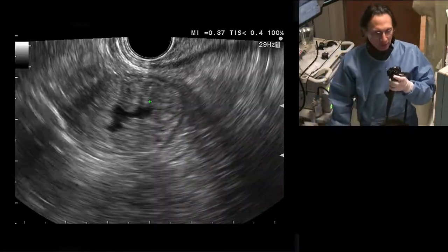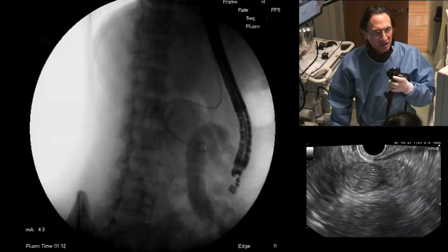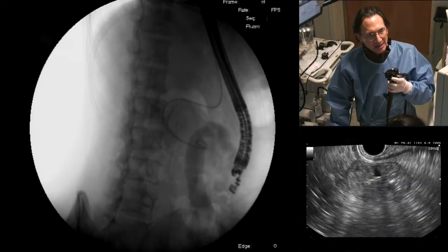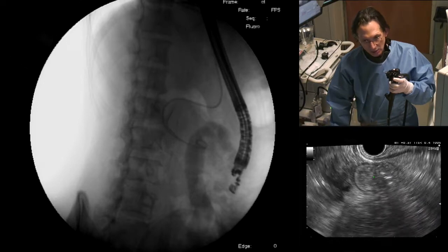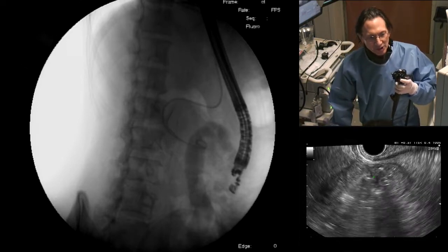And let's just look with fluoro so we know about where we are. So let's have a small fluoro image, or you can make it large. Very nice, very nice. You can see there's contrast. Somehow we got contrast. Did you put some contrast in the water, or I wonder how we're getting contrast in there? Maybe the residual. Residual, yeah.